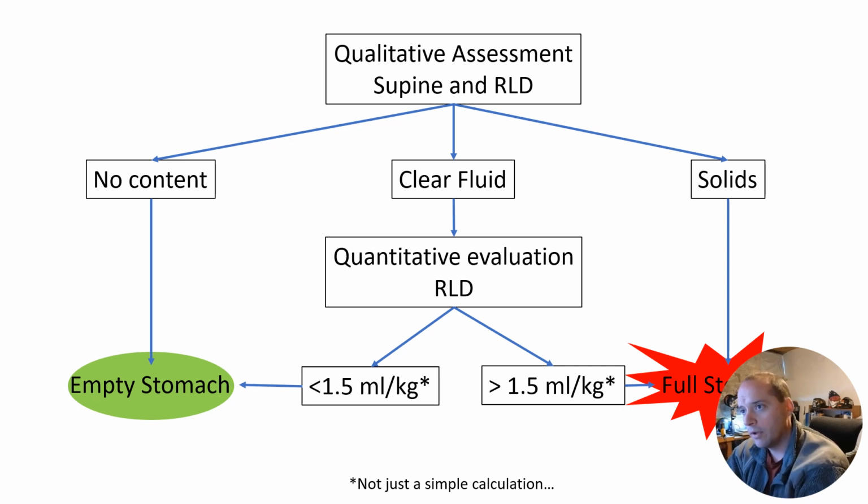Congratulations, move forward. If you do it in supine and right lateral decubitus and you see solid food, this heterogeneous, kind of nasty mush, that's solid food. There's food in there. That's a full stomach.